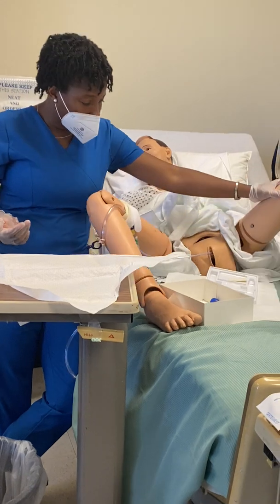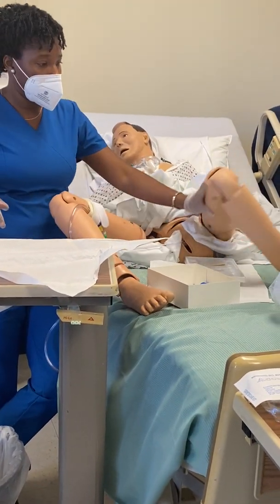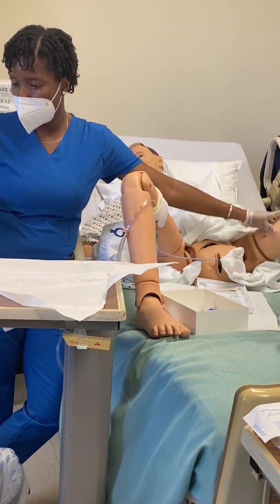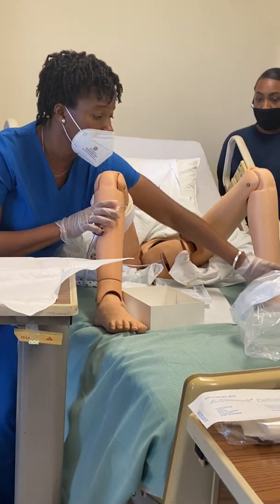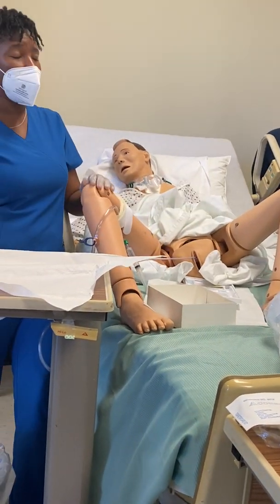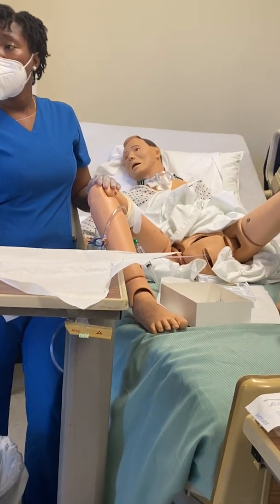I hope we can come to an agreement that you don't have to do that for competency. Okay, question now, what did you put over there in that little pack that came out of that pack? It was just 2 in here. So I just took one out so it wouldn't be in my way. It'll be 2 in your pack. You'll use this same kind when you do your competency with us. I would use one of those packs.